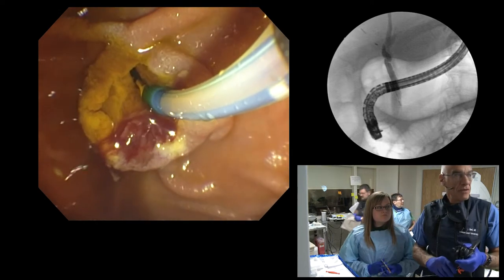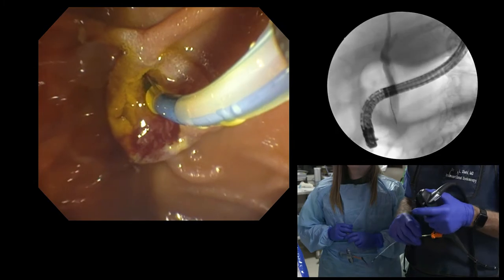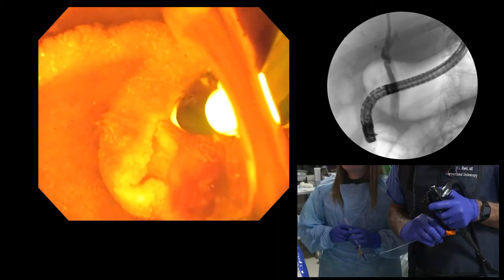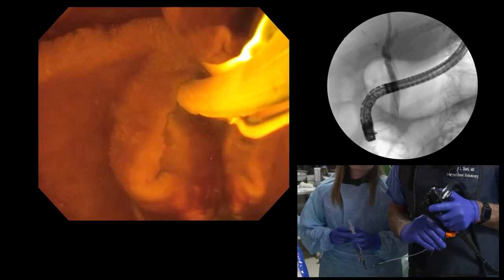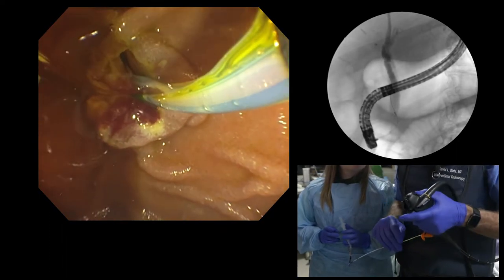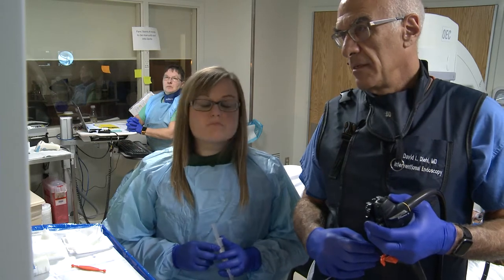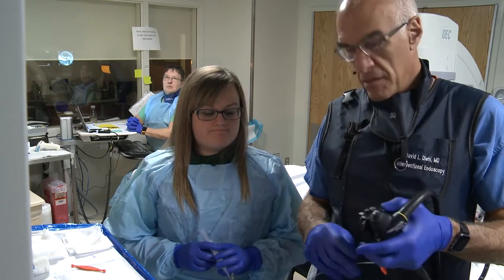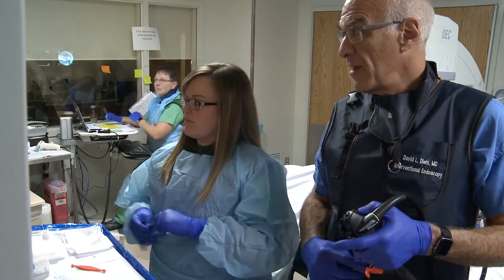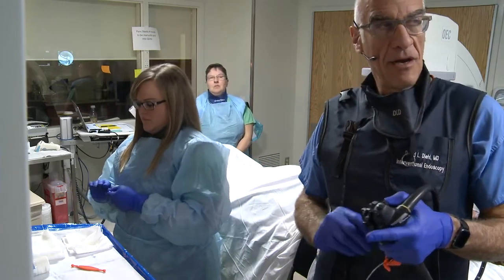Put it on low-dose here, please. Actually, regular is okay. We'll switch wires — I'll take this wire out. What wire is that? It's the Acrobat 2 angled wire. Okay, so this is the Acrobat 2 angled guide wire to see if that angled tip can assist me to find the take-off of the common hepatic duct.